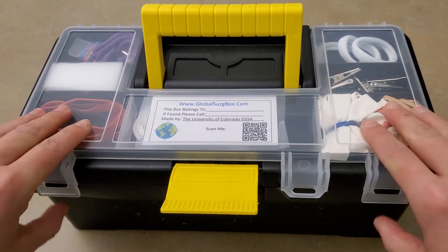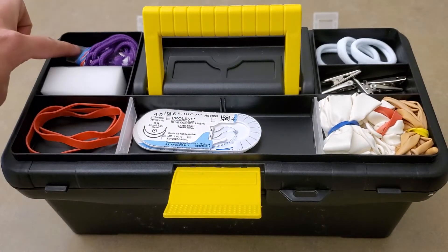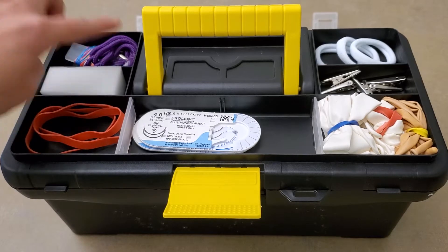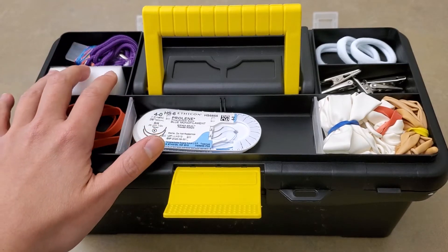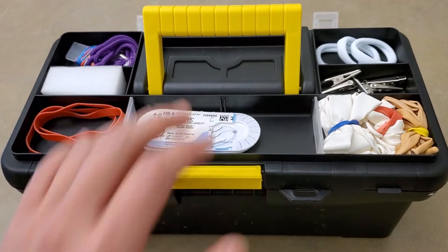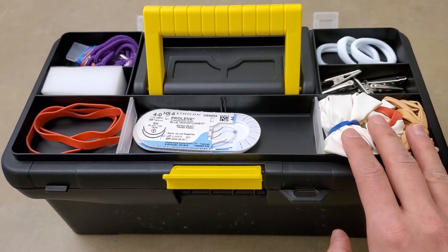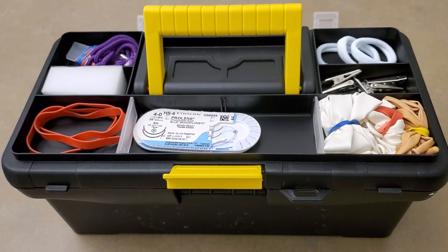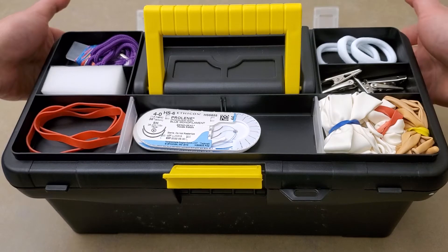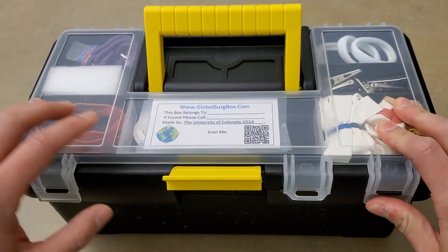Here in the lid, you'll see there are a lot of materials that you'll need for practice. For example, fishing line as well as shoelace for knot tying. You have a sponge that will store all of your needles. You have some expired suture that were given from the OR that you can also buy online. There are some hair ties used for suturing practice and different sized balloons that you can use for either bowel anastomosis or vascular anastomosis. We also have a QR code that takes you straight to our website.